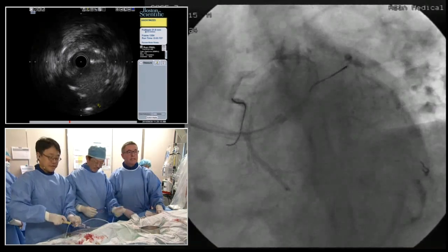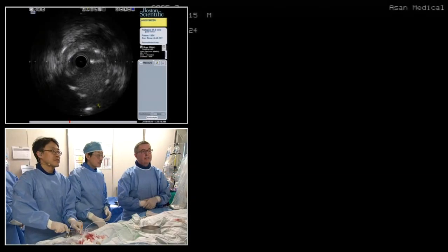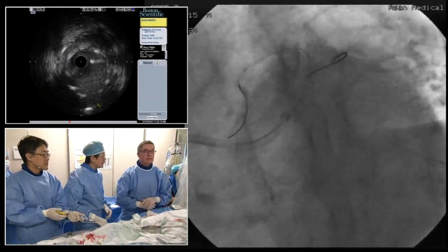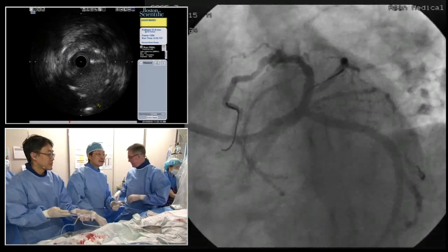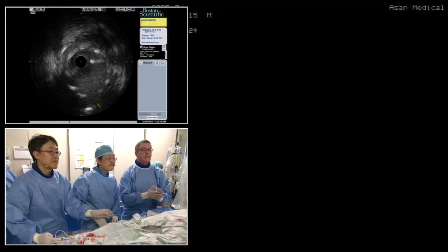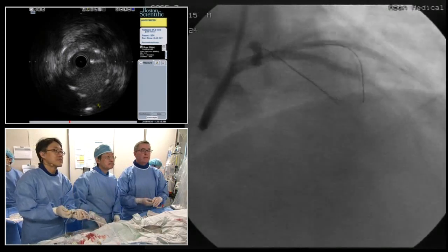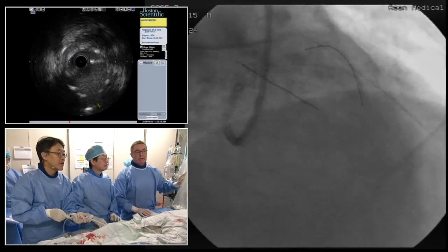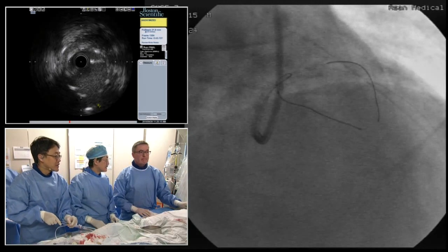So it's a little hazy there. So maybe let's have a steep AP cranial. Suggestion, we can do the AP cranial or maybe cranial. So we can always FFR this if you wish, but that's what I would do. I'm not sure. You probably need a steep AP cranial to show this. AP. You know, it is an interesting branch.